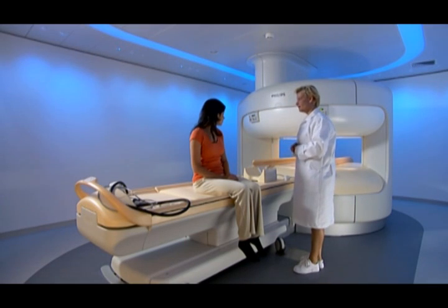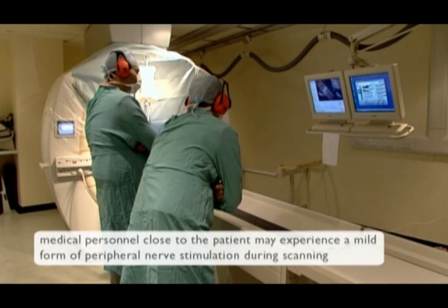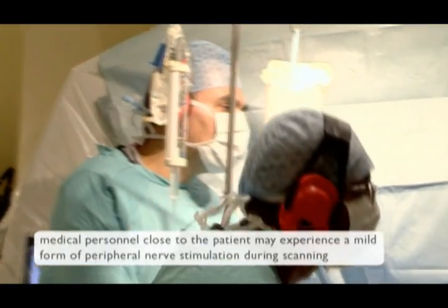A mild form of peripheral nerve stimulation can be accepted. This nerve stimulation effect is generally only relevant for the patient. As a result of the stray field, the effect may become relevant for medical personnel, such as an interventionalist who approaches the patient during scanning.